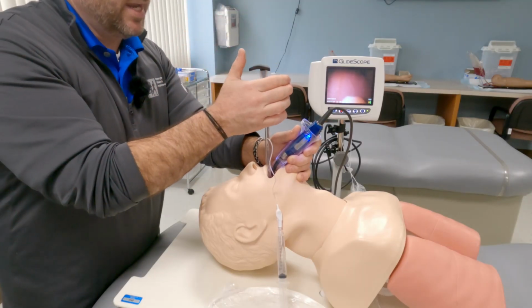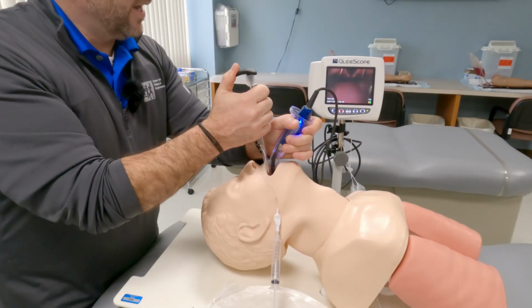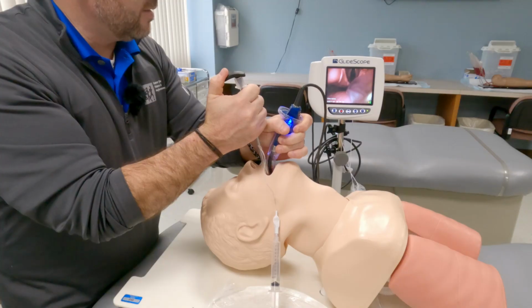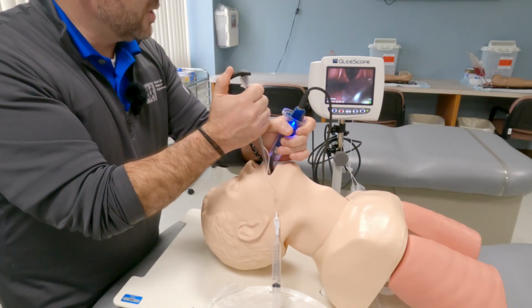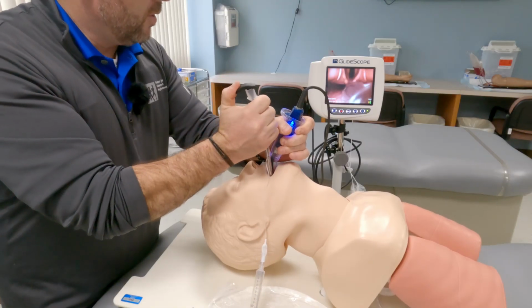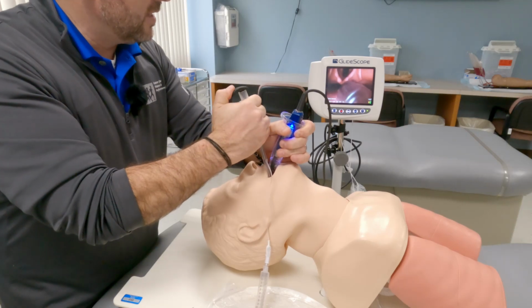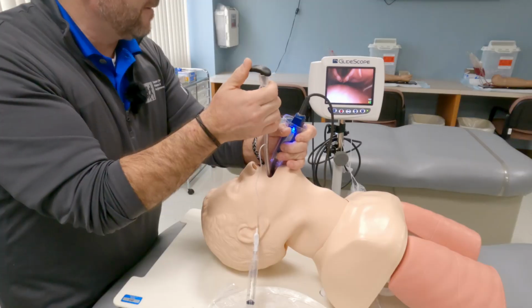Now I'm going to grab it right here. I'm not going to go down here. I'm going to grab it right here when I go to lift. Now you notice there's the cuff. You can see it on the monitor, and you can also see the cords. So in most cases you would think, I'm just going to push this in. Well, what happens if I'm just pushing straight down in? It's trying to actually go below, and you see if I work it enough, I can actually go, oh, that's bad. Don't go into the esophagus down there.